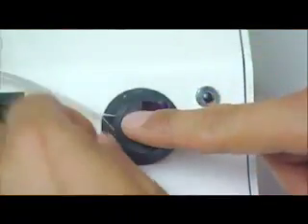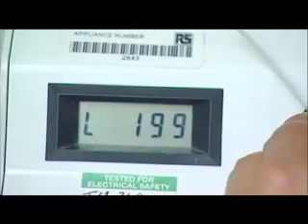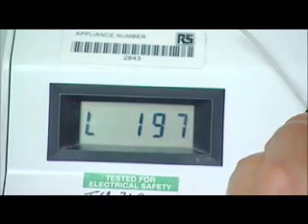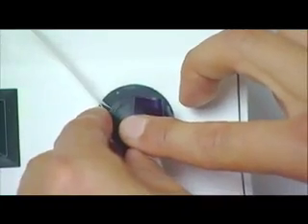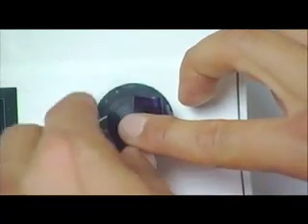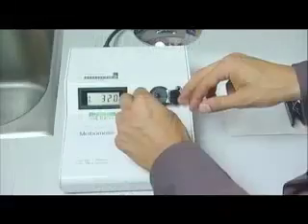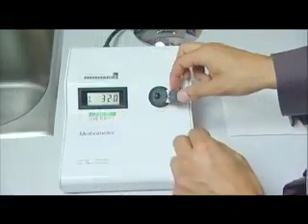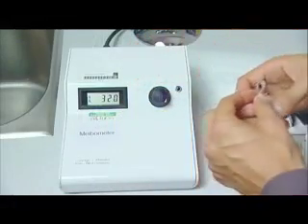A clean tape loop is used first to provide baseline data. Then the test tape is inserted and the procedure is repeated. The meibometer calculates the difference between the two readings and presents the result on screen in arbitrary optical density units.